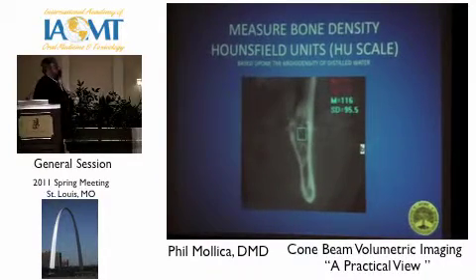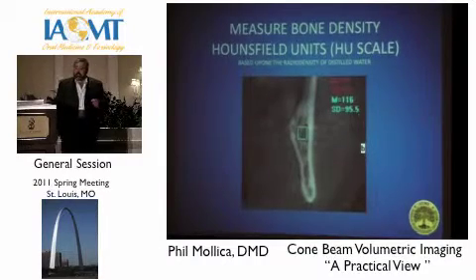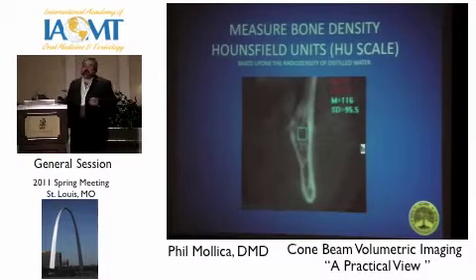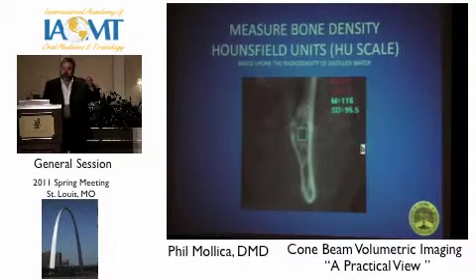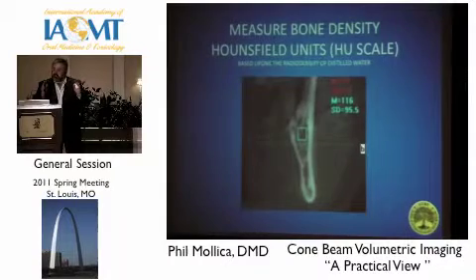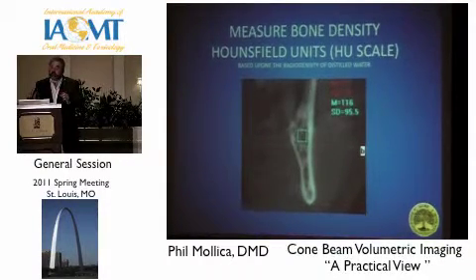But what's important to us, and this is one of the reasons we brought the 3D cone beam technology into the office, is that we've been, as you well know, doing work with ozone for a dozen years now. And we've seen this bisphosphonate issue coming along, being worse and worse and worse. We wanted some way to say, okay, here we are, this is what we have today. We're doing our treatments, and what are the ultimate outcomes, and can we measure this?